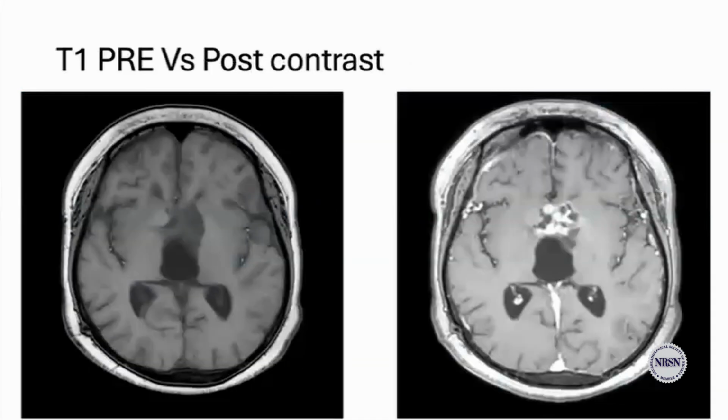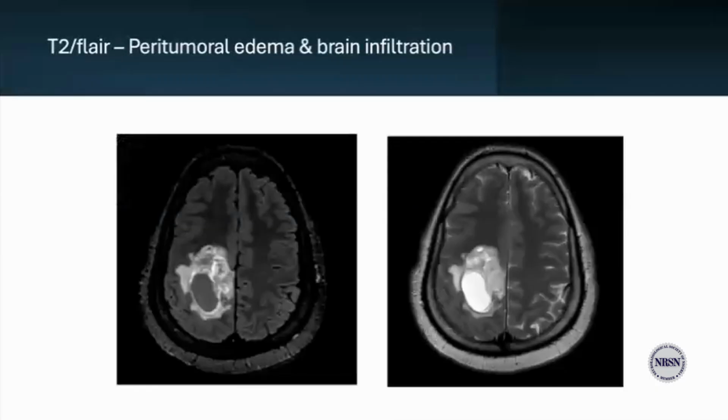This is just an image showing a T1 pre-contrast and a T1 post-contrast, demonstrating the role of gadolinium. Now we have a FLAIR and a T2 image here. And when comparing these two, on T2, both CSF and edema are bright. You have to always keep that in mind. And these may lead to confusion or masking of edema.